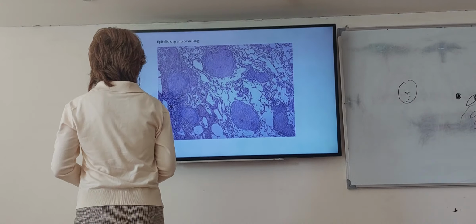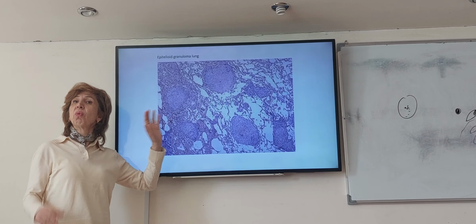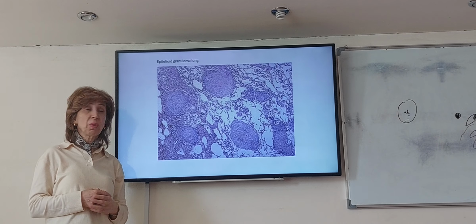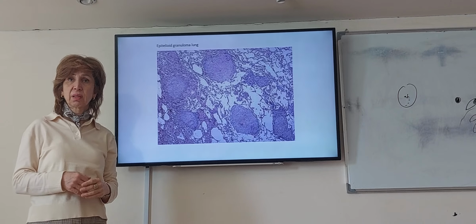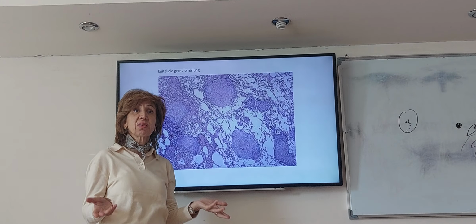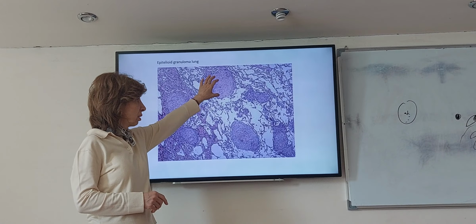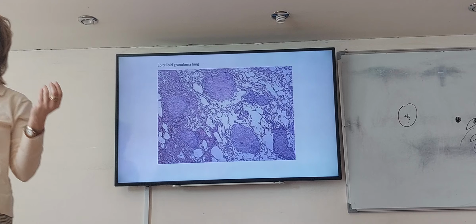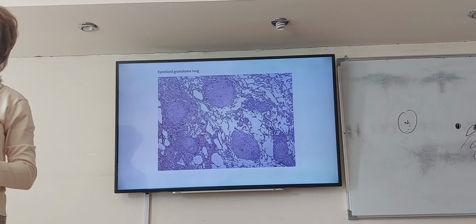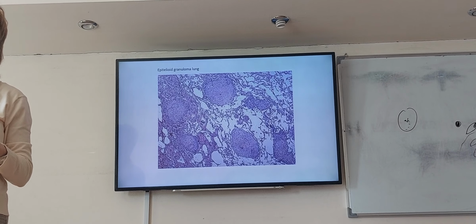Now, I will start. If I put a picture like this, where are we? Lung. What happens to this lung? Granuloma. Before granuloma, what did you see? Chronic inflammation. How can you describe this? Do you see destruction? Because I don't see parenchyma in these areas. Yes, I see destruction of normal architecture. I see nodular aggregates of eosinophilic color. That's what you see from the beginning, and that's what will be in your exams. You see lung, you see areas where you don't see any parenchyma.